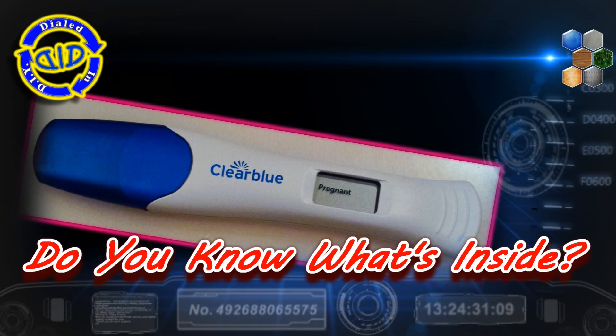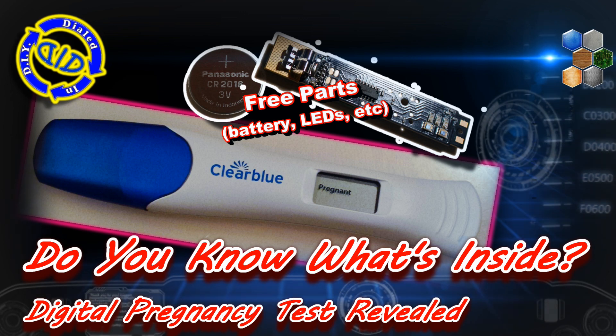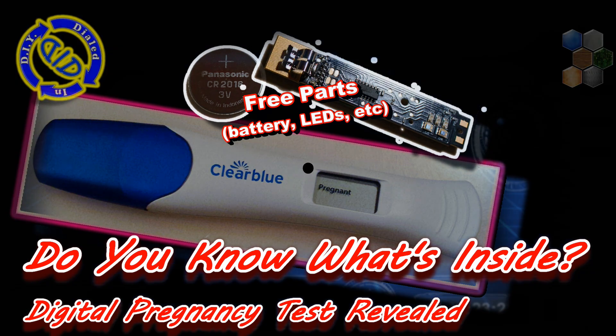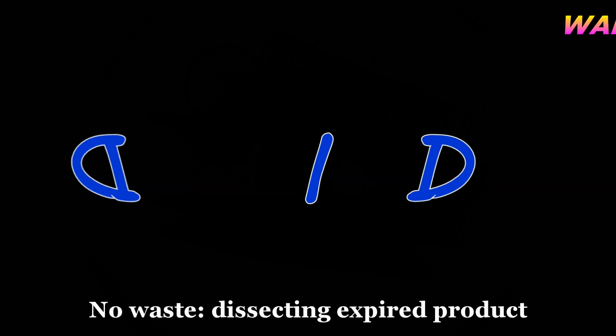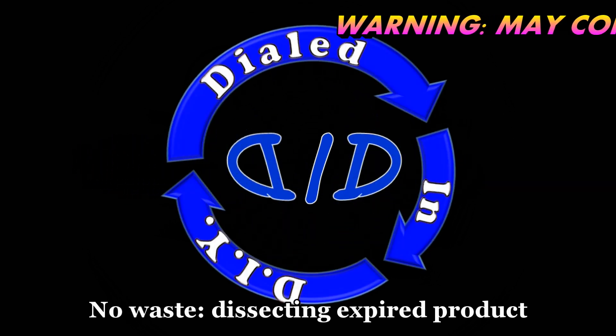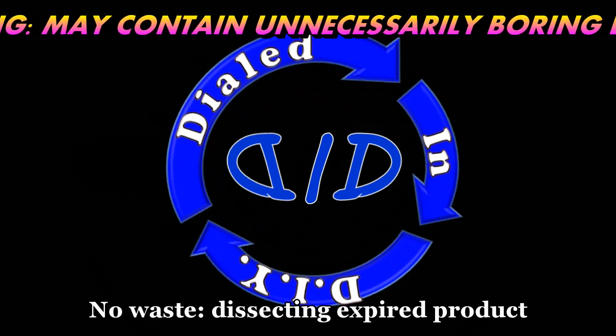Welcome back! Today on Dialed In DIY, we have a triple threat with a pregnancy test. We're going to deconstruct it, talk about how it works, and then see what we can salvage for use in other projects. Like many of my previous projects, I'm working with something that would have either been thrown away or recycled, but in this case it was actually an expired product, and I'm using it for new purposes.